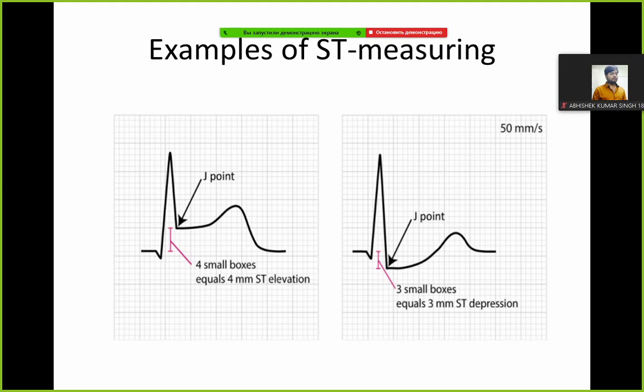The magnitude of ST segment deviation is measured as the height difference in millimeters between the J point and the PR segment, the baseline.